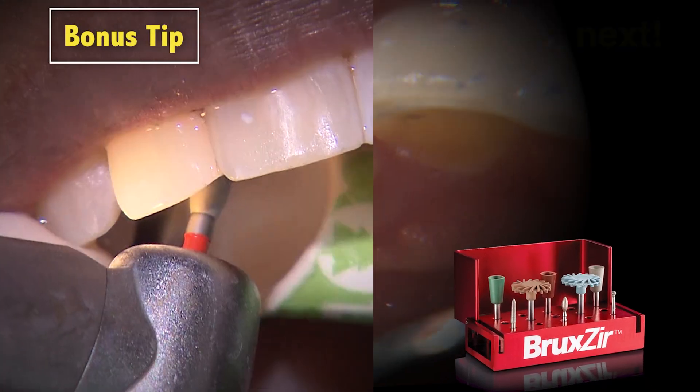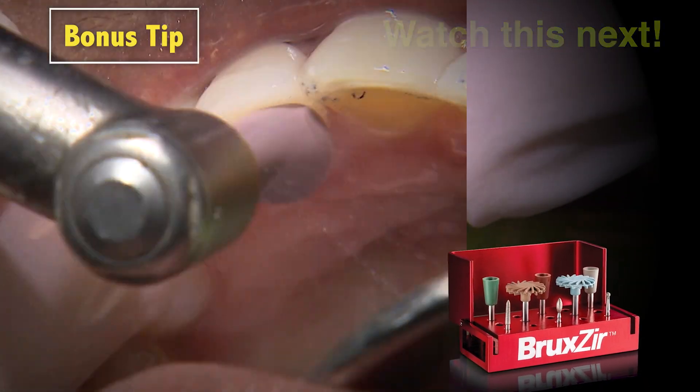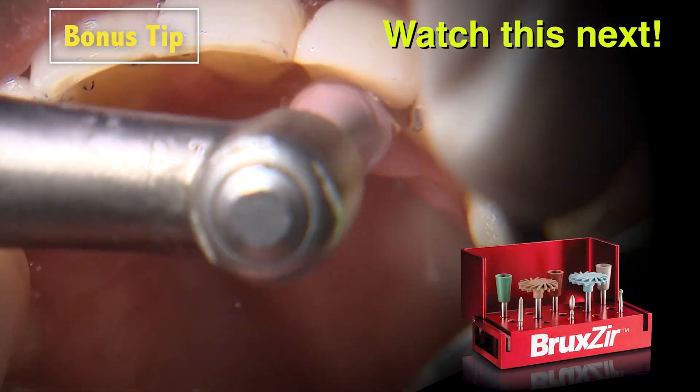Adjustments to Bruxer aesthetic can be made with a fine-grit diamond bur and then polished smooth with a diamond-impregnated polishing wheel.